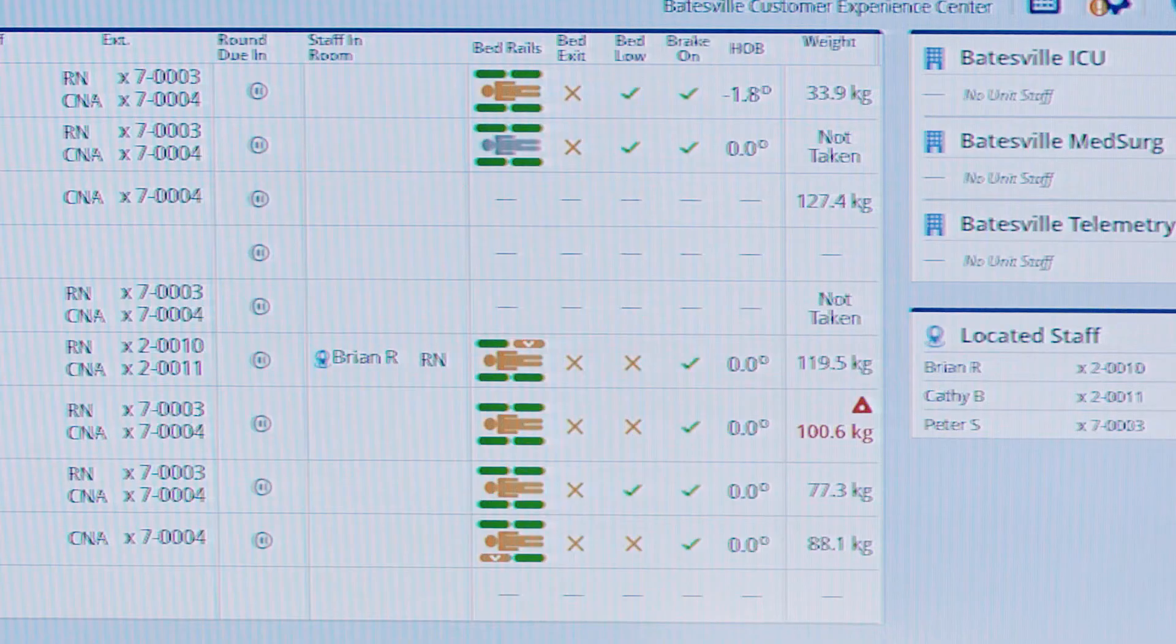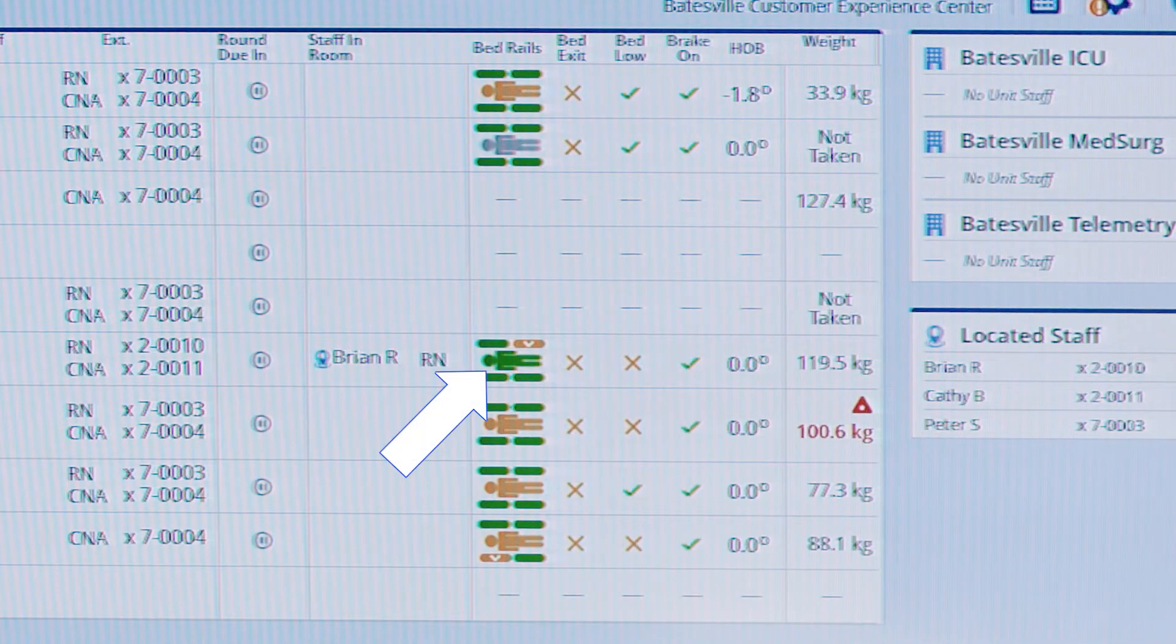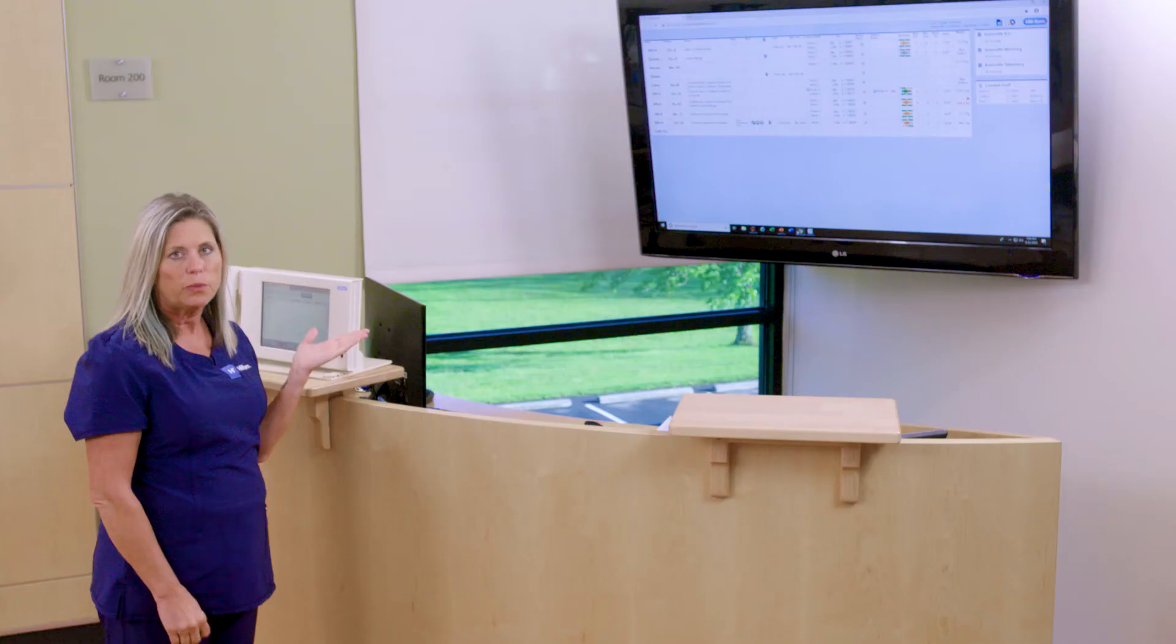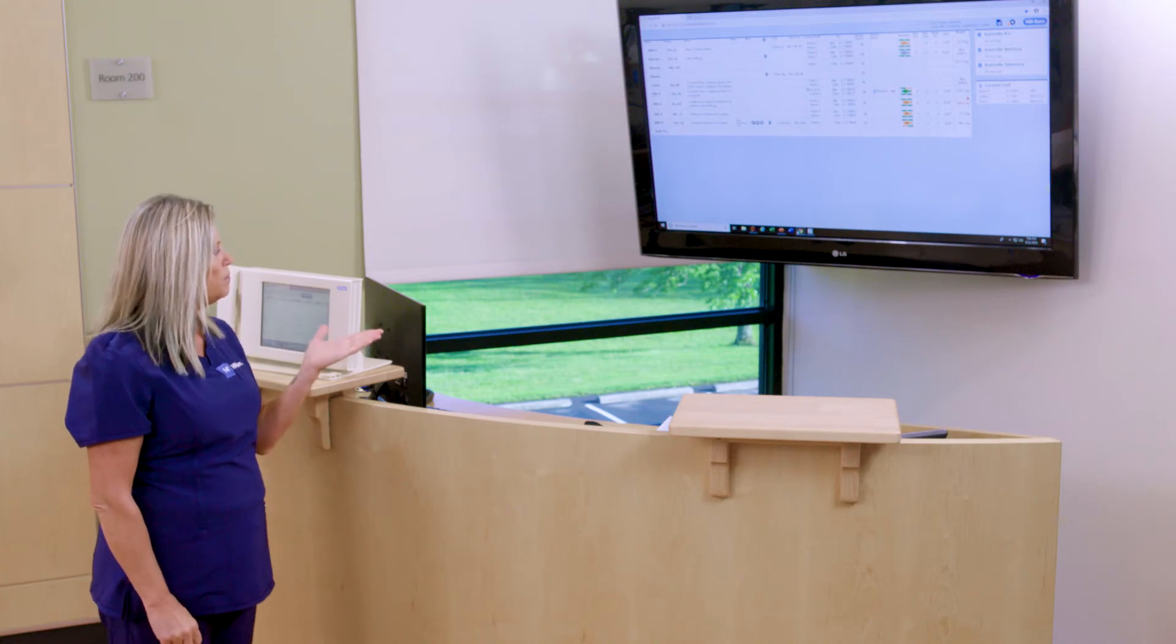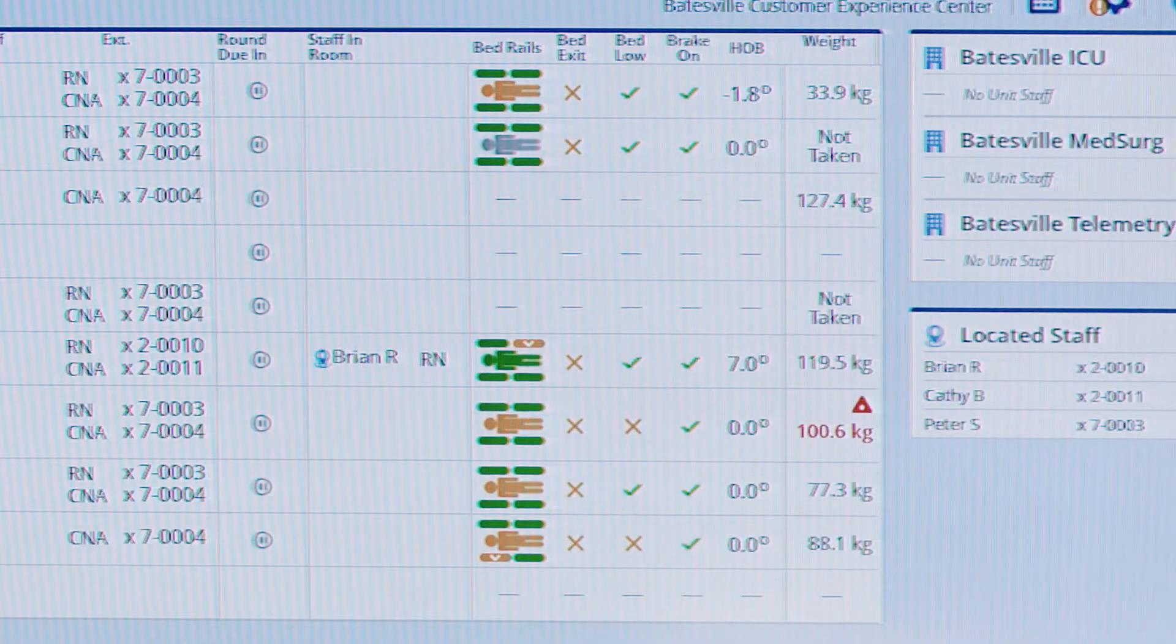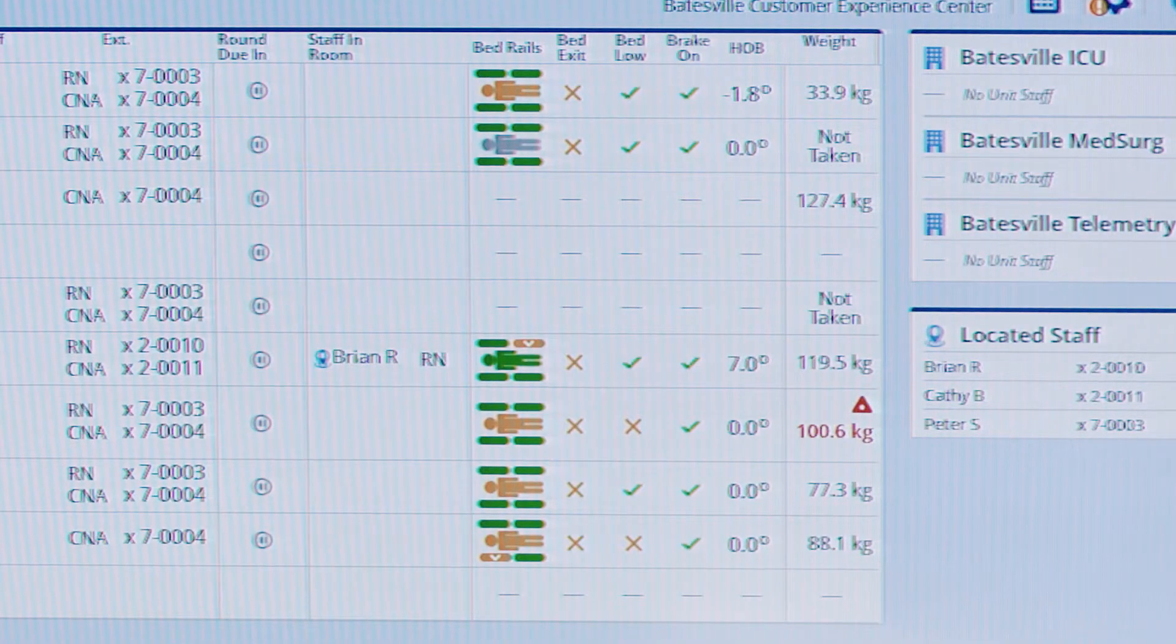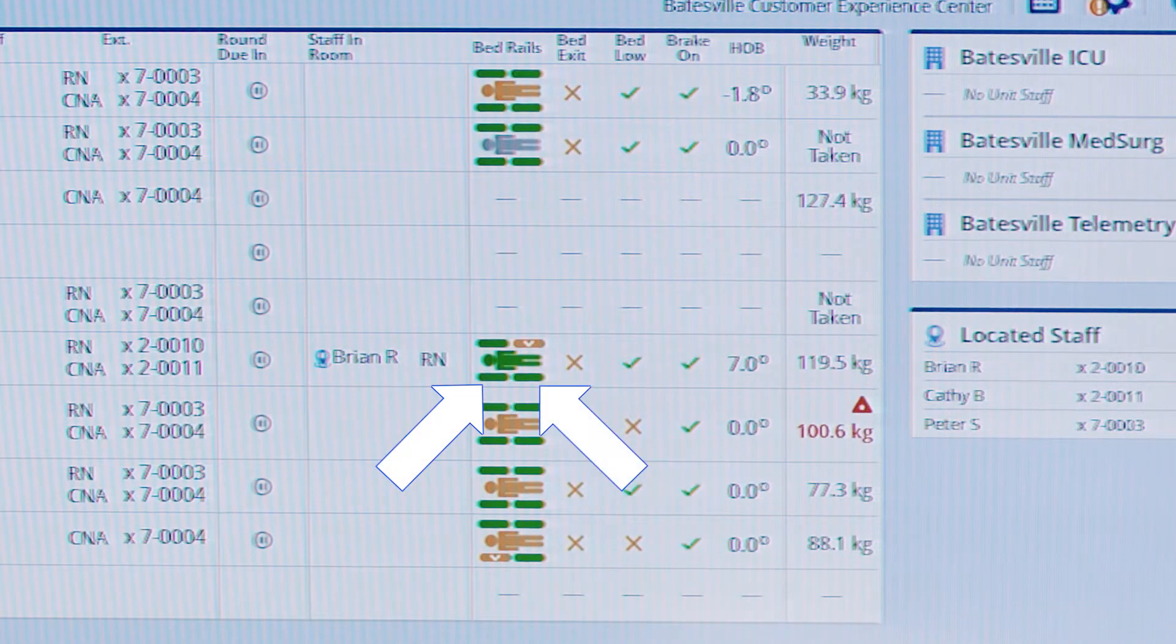You can have visibility to whether a patient is present in the bed. The green body is an indicator that we have a patient weight detected in that bed. We can also see visibility to side rail position of the bed.